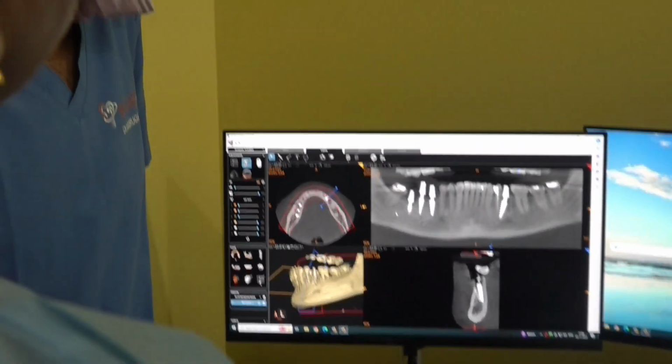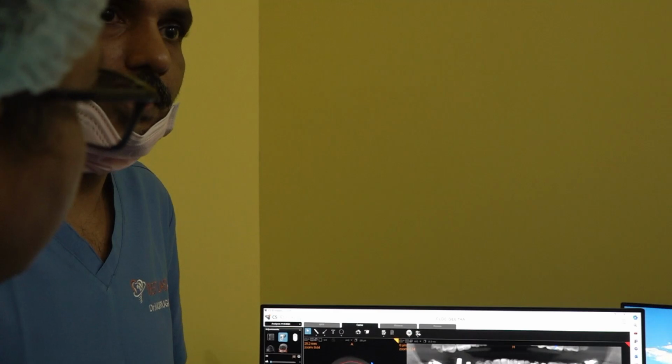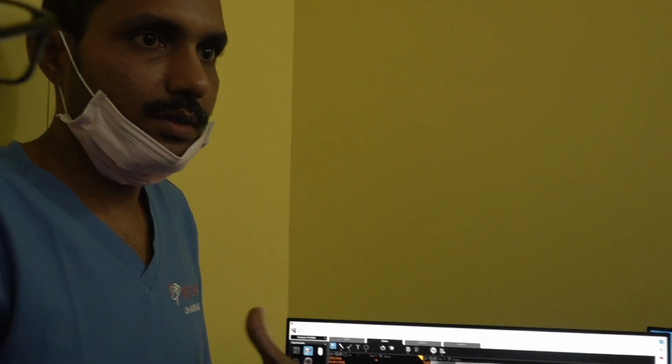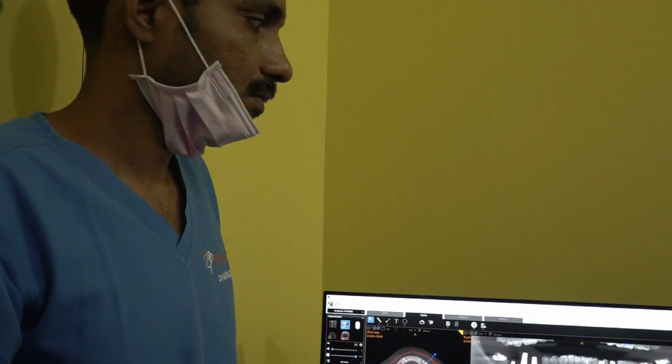Intraoperative, not only after implant placement, but during drilling, during implant placement itself, consult at 60 to 70 percent, then take care. So the RVG and laptop should be a must. Yes. So these kinds of things can compensate for the lack of experience.